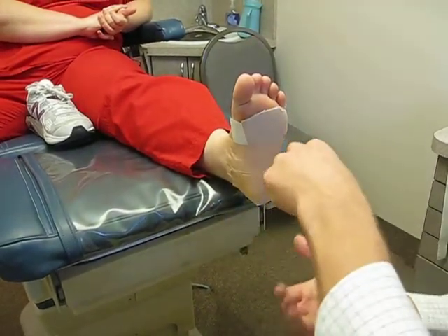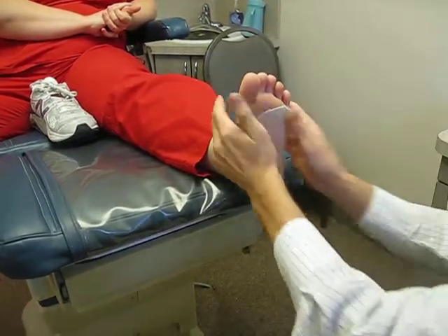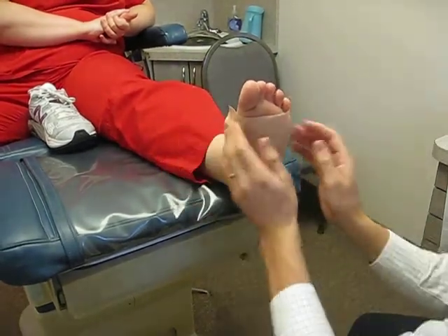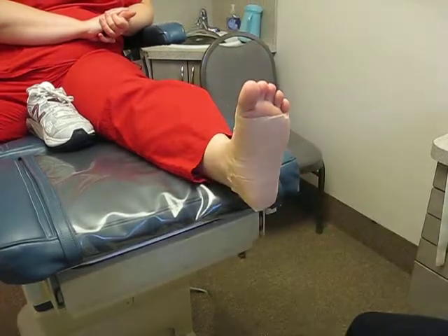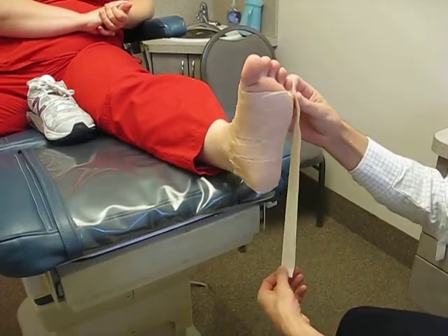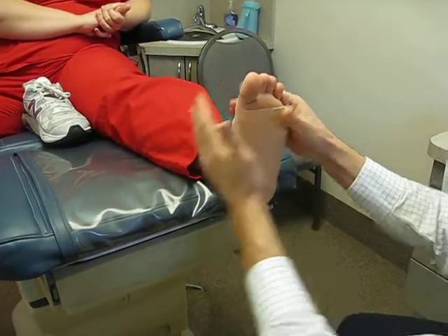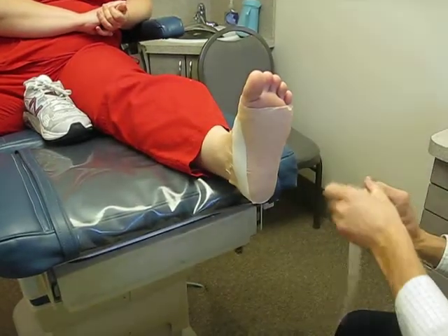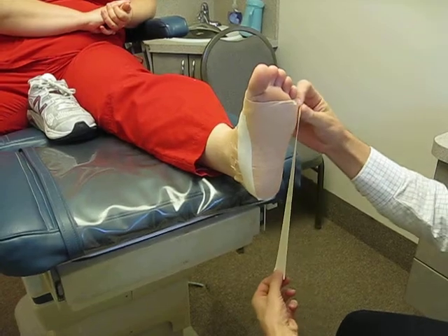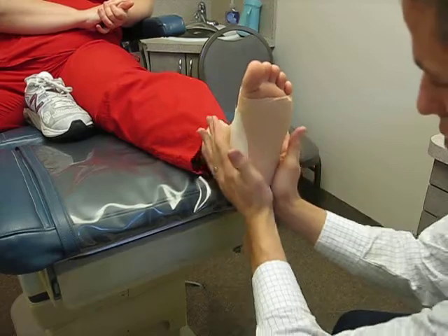I like to extend the layers out up to about the ball of the foot. Come back to the 1 inch tape, again taking care to bring the arch down a little bit each time. The whole idea here is we're creating an external support for the plantar fascia, mimicking what it's doing and holding the arch up.